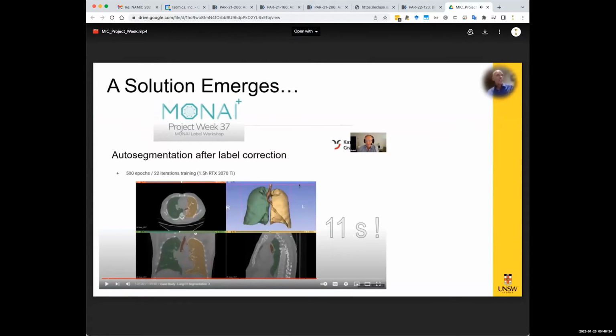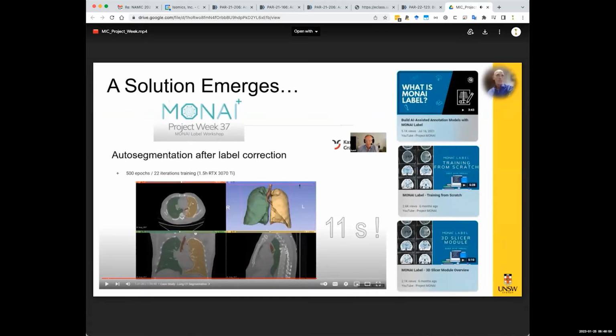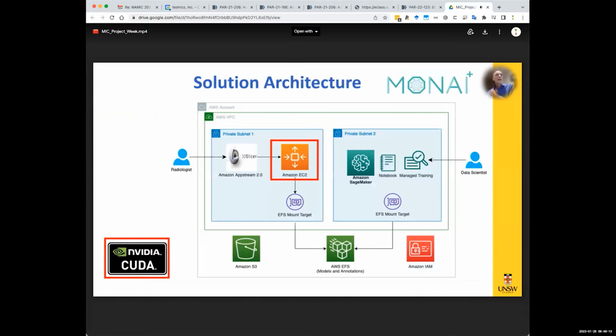I've searched in vain until really just a few months ago when I stumbled across, ironically enough, a MONAI Project Week presentation, and I know that Dr. Bumm is there with you today or presenting as well. And I watched his presentation on segmentation of lungs. And I also watched all of the MONAI Label videos presented by Andres. And following that, I actually reached out to Andres, who was very generous with his time and helped me set up my own solution.